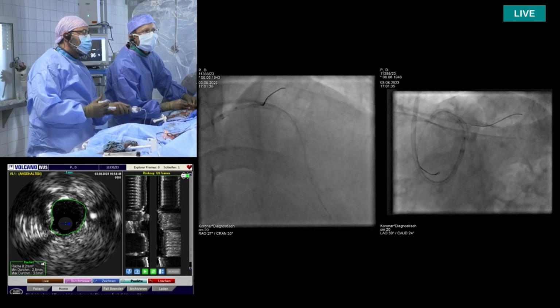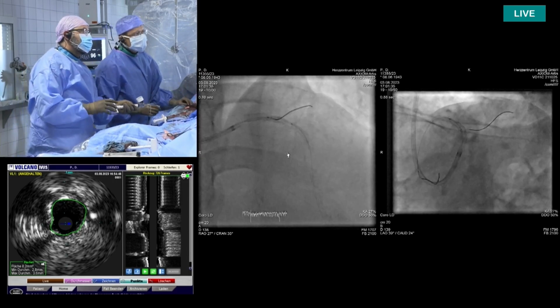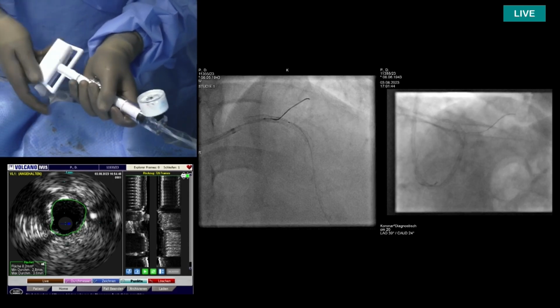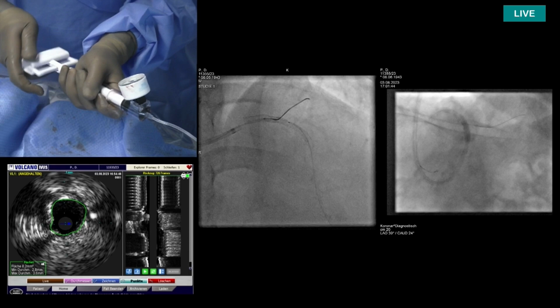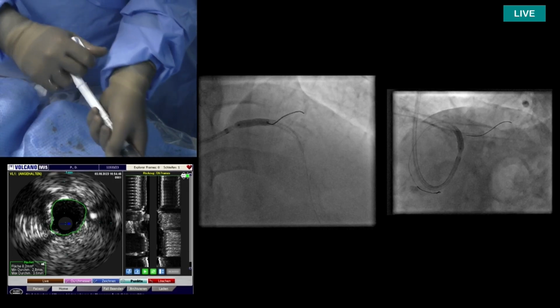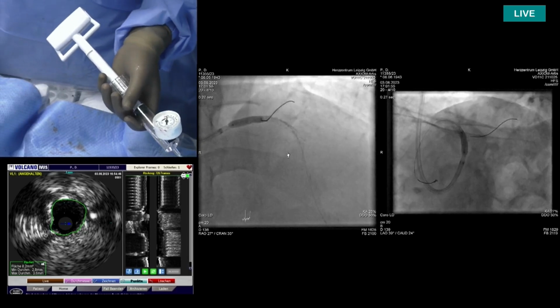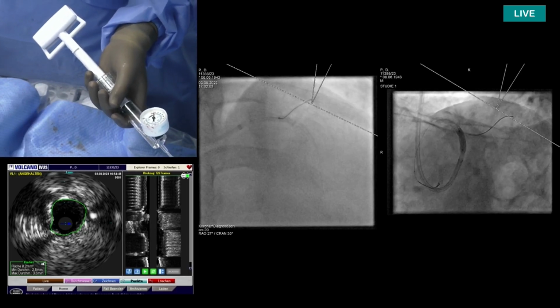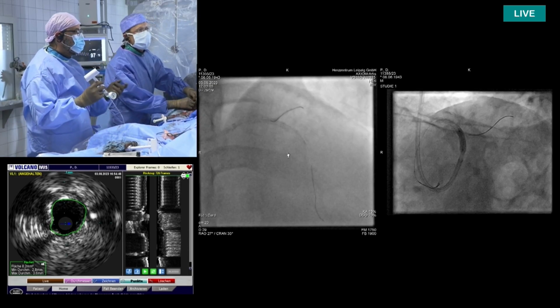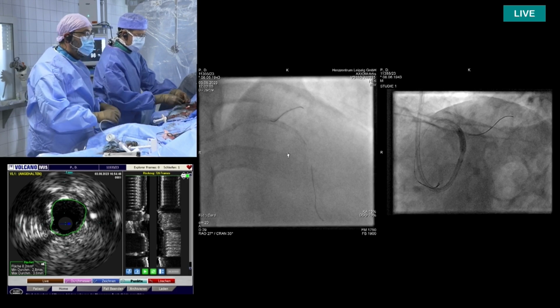So Mohamed, we're going to have 2 more minutes. Can you let us know what your plan is for finishing the case? You're going to place the stent, post-dilate, and what is your plan? Yeah, we already placed the stents, actually 2 stents as mentioned. This is the post-dilatation balloon, a 3.5 non-compliant in the left main. And maybe before we leave you, we do an angiogram. And then afterwards, what we're going to do is definitely always also post-dilate the distal stent with a smaller balloon, then do final imaging, and hopefully that's it.